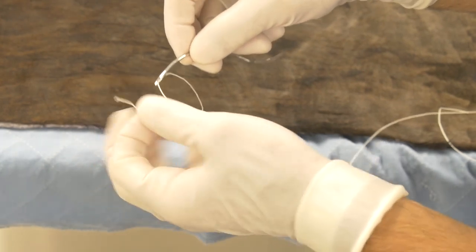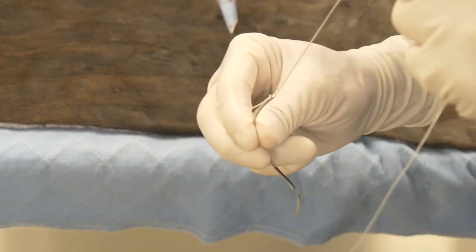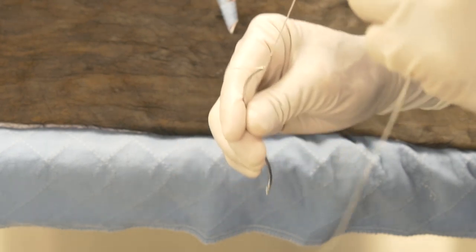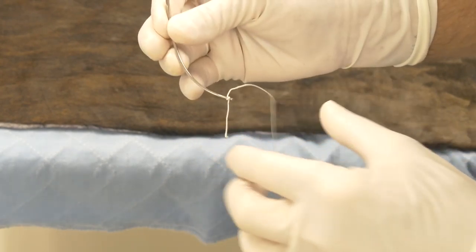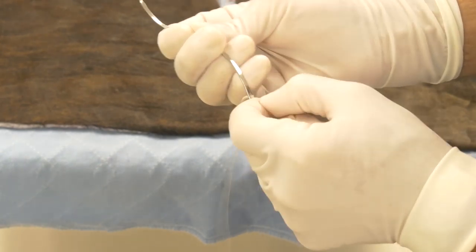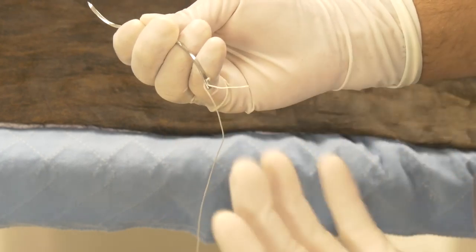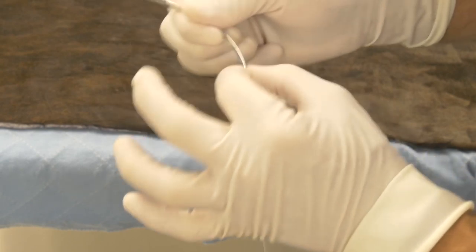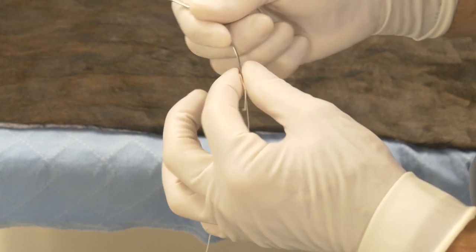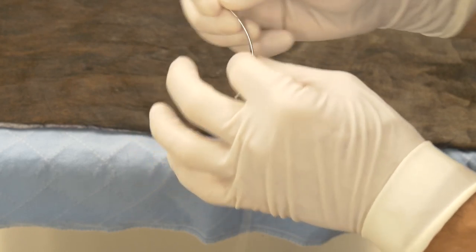Some people like to pass the suture back through the eye a second time, which effectively locks the suture into place and decreases the likelihood it will slip out. However, this increases the amount of suture wound around the end of the needle, increasing bulk and resistance to passage. When that last part of the needle passes through the skin you'll feel it catch a little, but with gentle rotation and wiggling it will typically pass through.